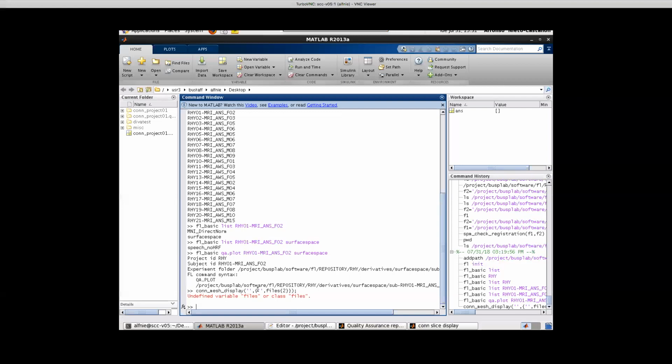But I think the main goal is to come up with things that will make our life simpler in terms of easily identifying problems, so that when you look at those displays, you can tell confidently that everything seems to be fine, and you can trust your surface level analysis because the correlation seems fine and the surfaces look fine. Something that tells you at a glance that there haven't been any problems. So if you can think of any plots, I'll be happy to optimize the plot generation to accommodate whatever you think works best. Okay.